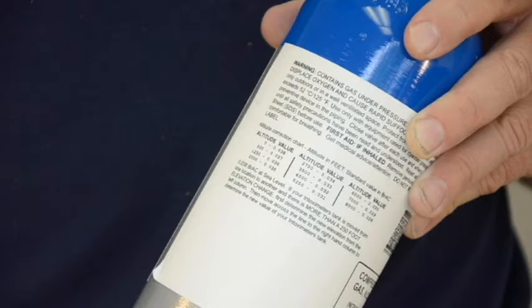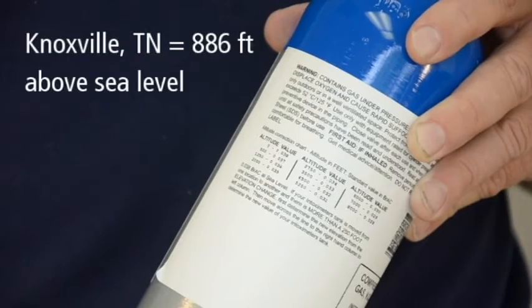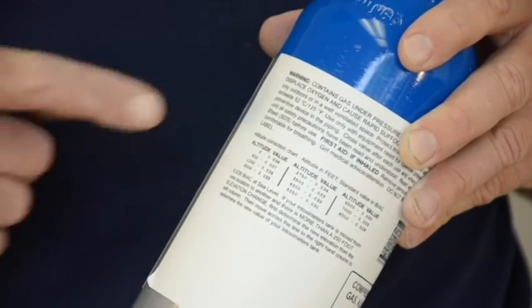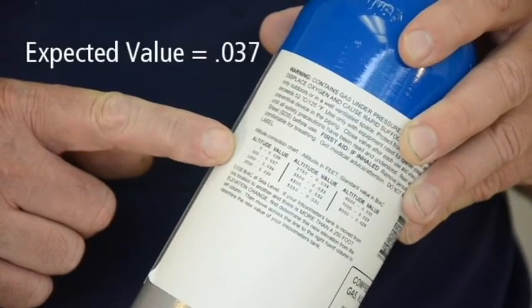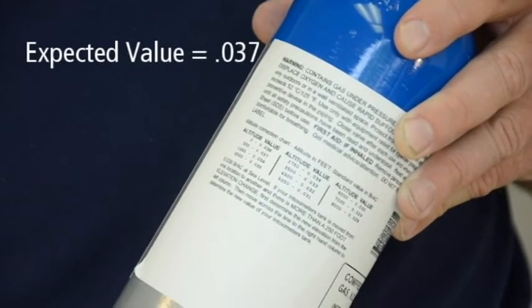if you are performing a calibration in Knoxville, Tennessee, which has an altitude of 886 feet above sea level, the altitude chart shows the expected value of the alcohol gas tank to be 0.037.